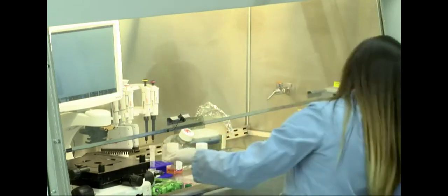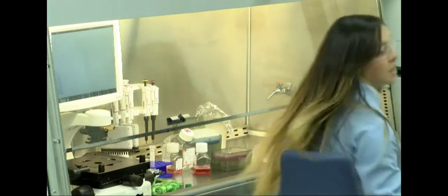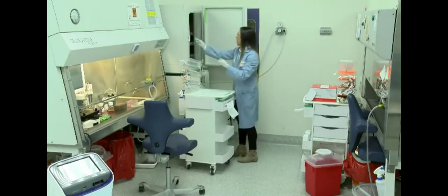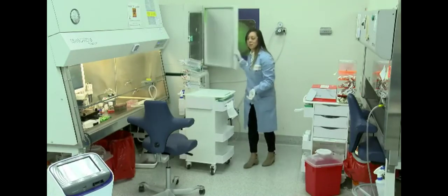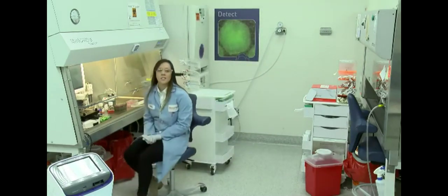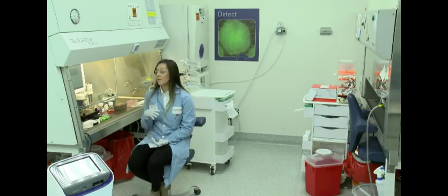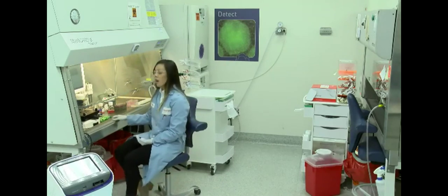Perfect. So once those are added, these can actually go in the incubator. And you can start the neuronal maturation process. So we actually observe maturation markers using our B27 and B27 Plus media systems, even after 3 days in culture, once you plate for maturation.